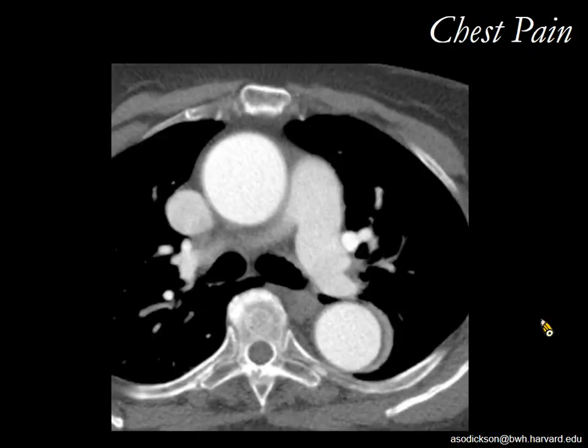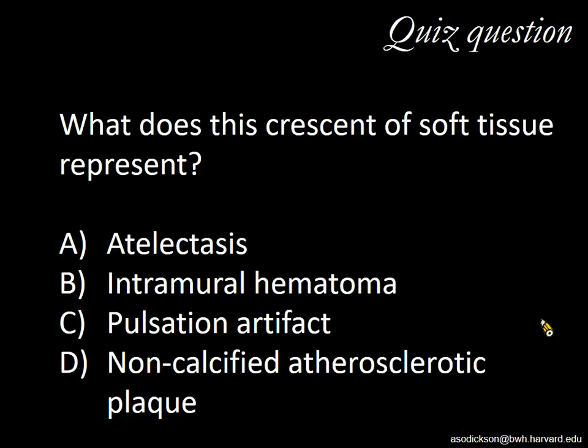Oh, let me show you the image, sorry. I know it's artificial to see only one image, but this is the game. Should I skip the voting? Oh, there's no question? Okay, all right, well then, never mind the question. But this is a trick.